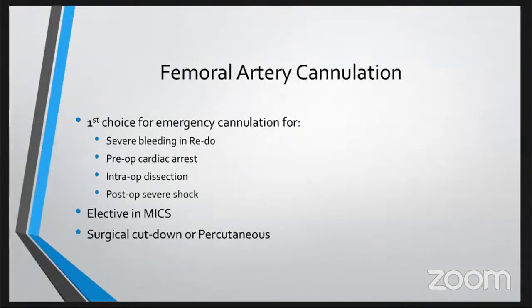Moving to femoral artery cannulation, it's usually the first choice, as we said, for emergency cannulation in case of severe bleeding in redo cases, pre-op cardiac arrest, intra-op dissection, and post-op severe shock. And it will be elective in cases of minimally invasive cardiac surgery. It can be performed with surgical cut down or percutaneously.